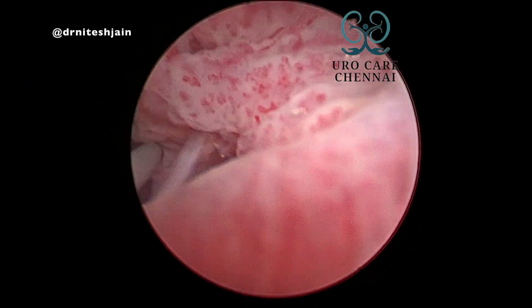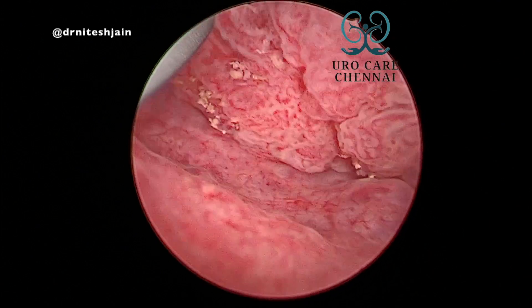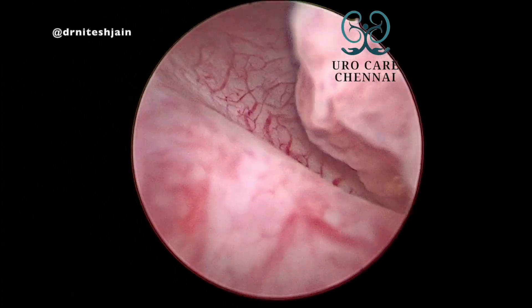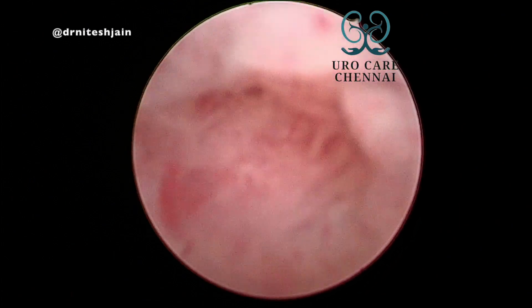Sharing tips for TURBT for a large bladder tumour of around 3 cm sitting right on the left VUJ — how to resect and how to manage such a patient.